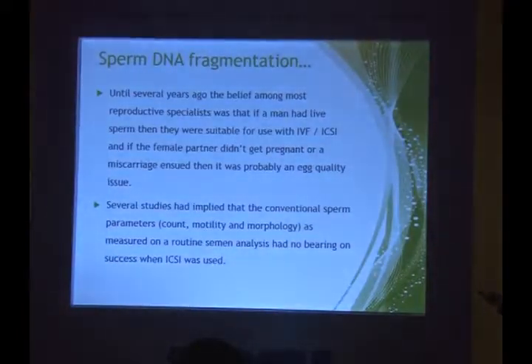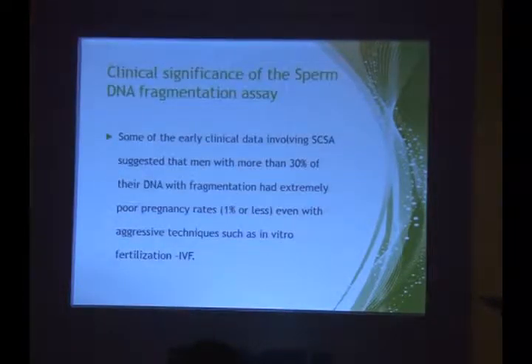It will tell you that if the DNA fragmentation is increased, the chance of pregnancy is going to be very low. So more than 30% DNA fragmentation, in spite of normal count and motility, would suggest that this patient doesn't have a chance either with IVF or naturally. So you can advise this patient accordingly.